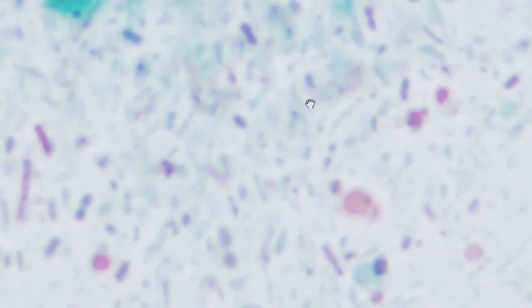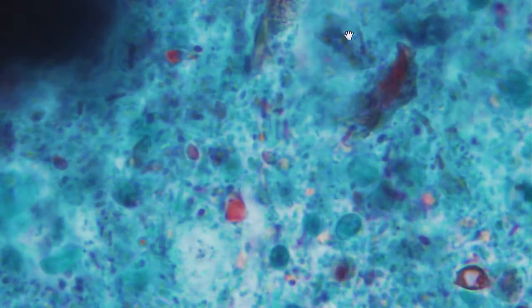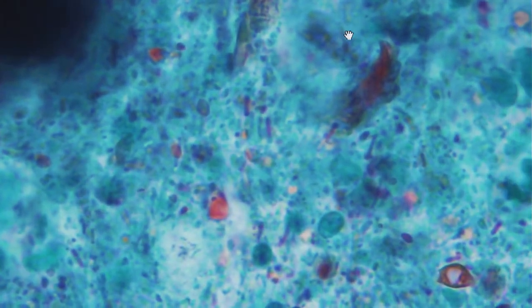So this is a trichrome stain. What you'll see here is all these lovely bacteria staining up red and blue and green. It's a very pretty stain. I'm going to move down to a slightly lower magnification, might make it easier for you to see things. There we go. And let's now move around and see what we can find in here.